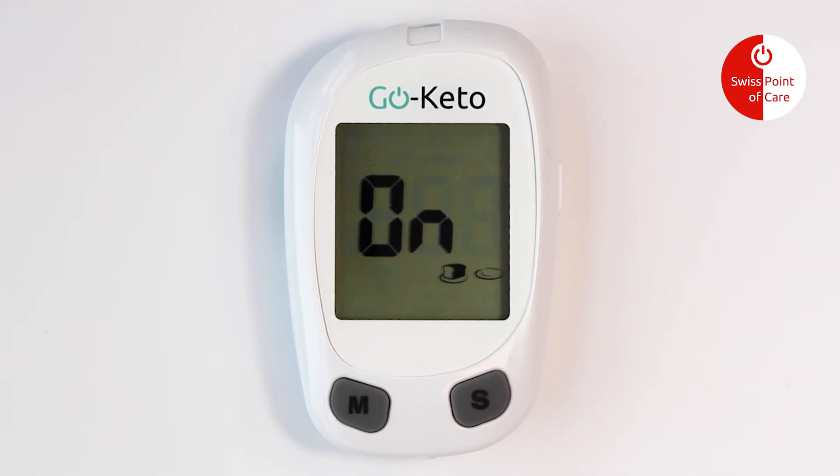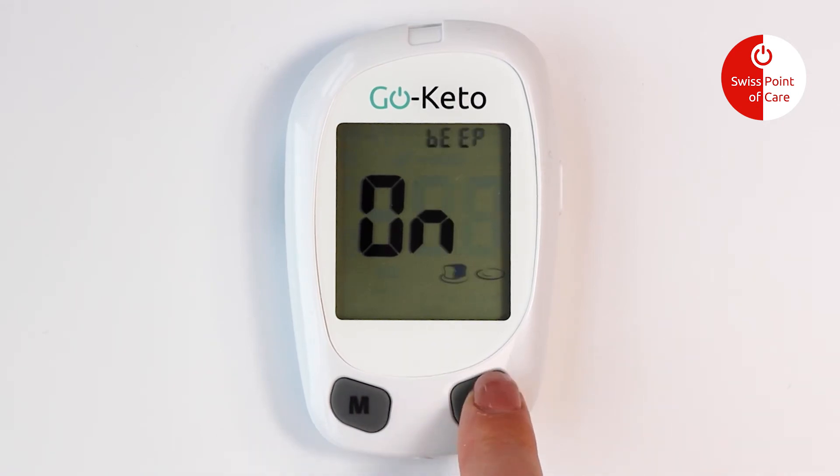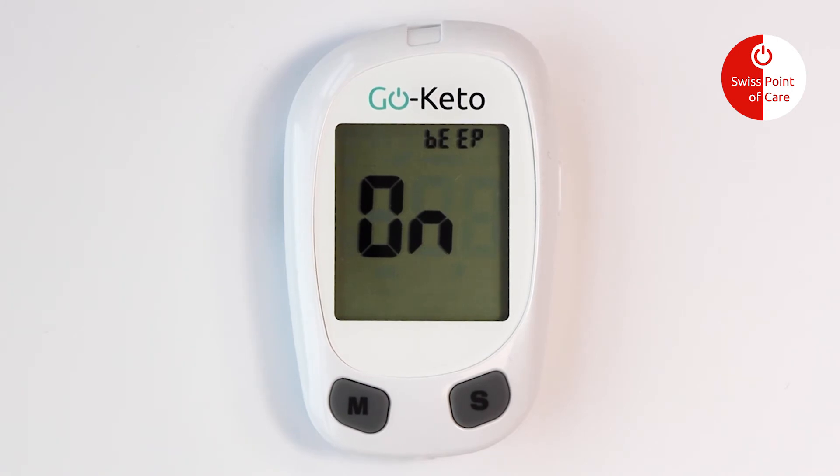Press the M button to switch the meal marker on and off. Press the S button to confirm your selection. Use the same steps to set the audio feature and keytone indicator.